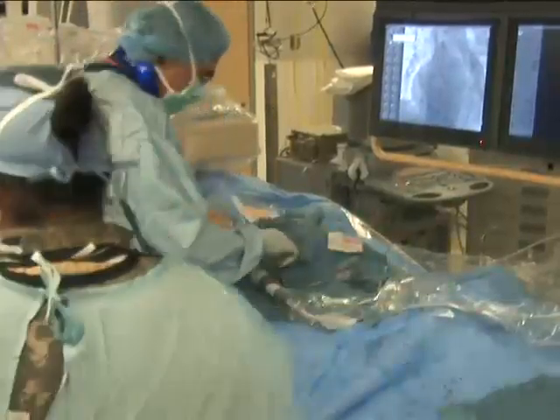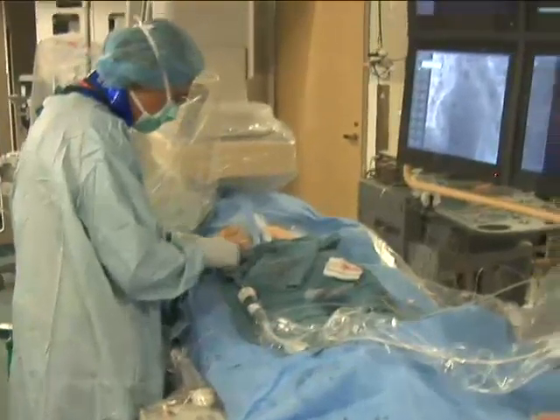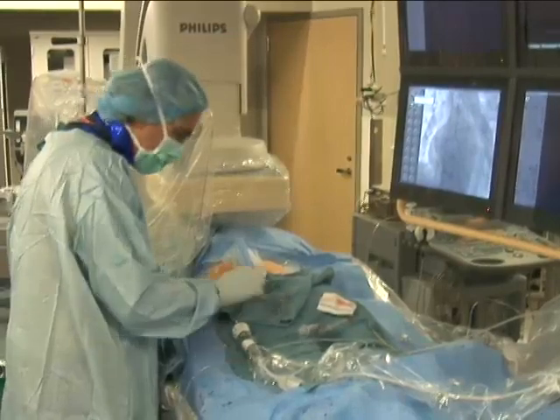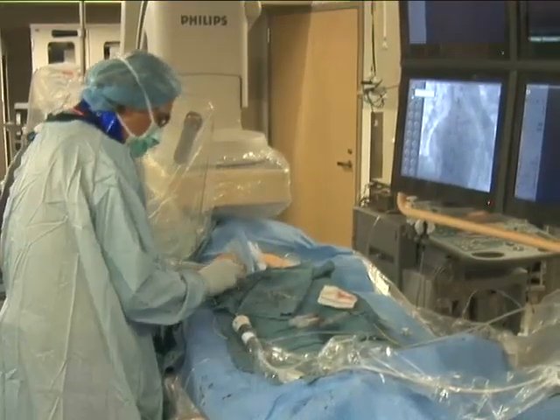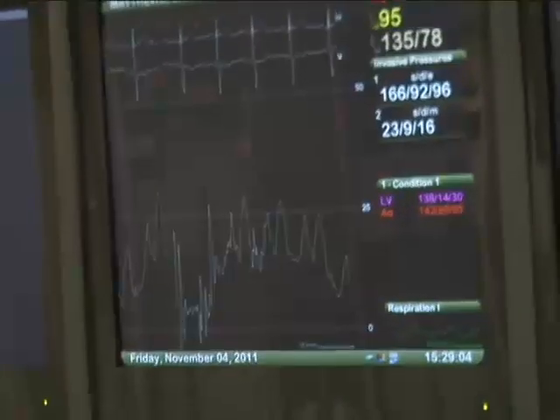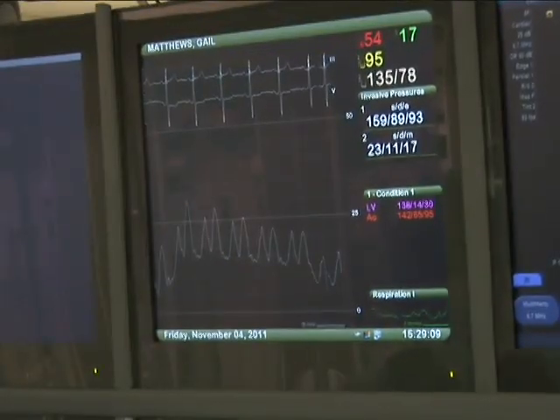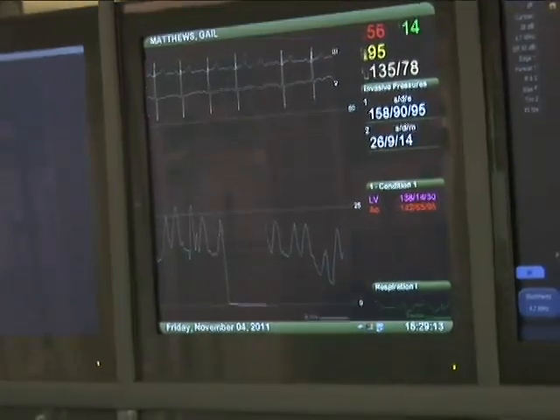Parenteral heparin is administered, typically sufficient to achieve an activated clotting time, ACT, of at least 200 seconds, with higher numbers preferred by some operators. The catheter may be exchanged over a wire, either a 0.032-inch coiled wire or a 0.035-inch exchange-length J-tip wire, often placed into the left upper pulmonary vein for stability and to avoid inadvertent catheter placement in the left atrial appendage, which can be more thin-walled and easier to perforate.